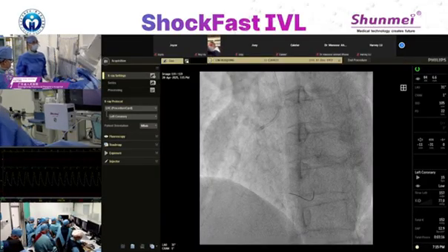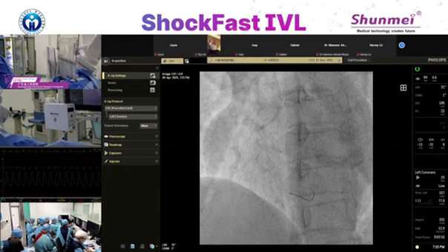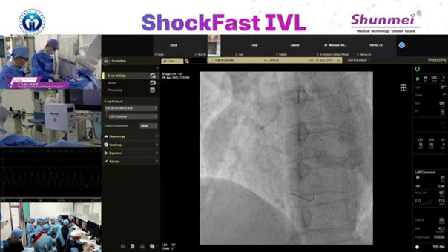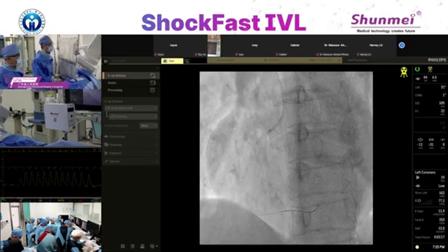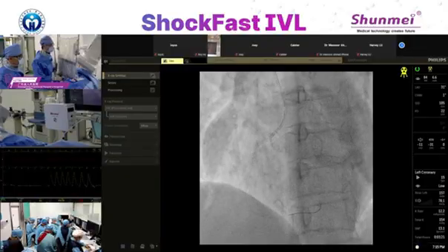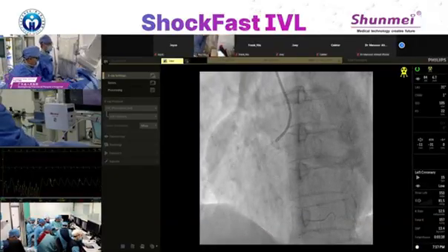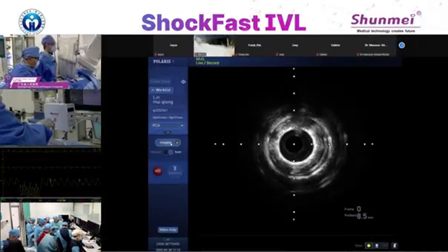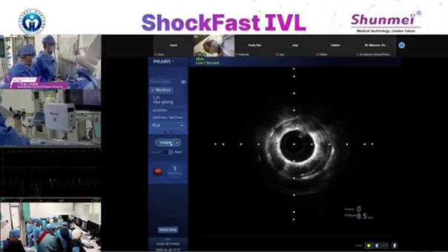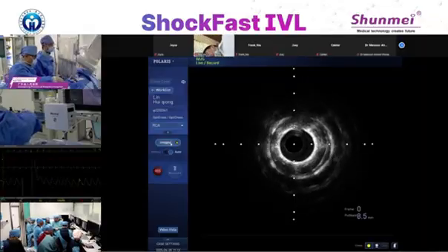I'll give some nitroglycerin. 300 micro nitro. I'll give it into the coronary artery. Okay, let me check the angio again.